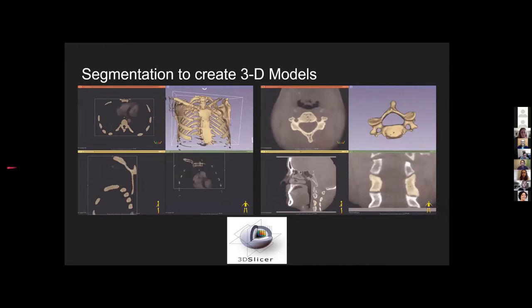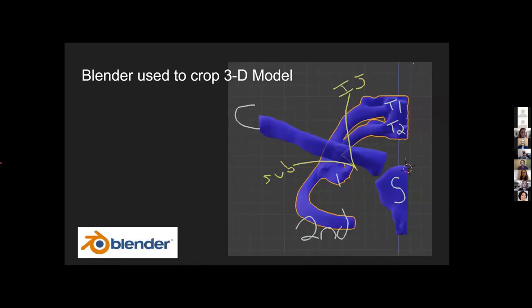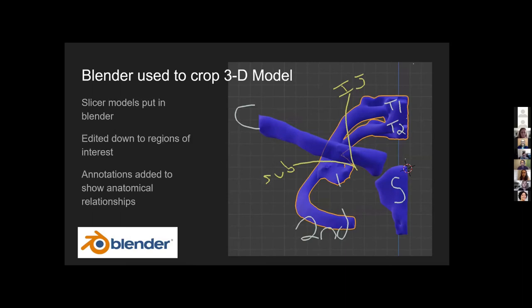So how did we do this? To start, I segmented CT data using 3D Slicer. I segmented the entire thoracic cage and a couple cervical vertebrae. We figured we could start broadly and then reduce the scope of the 3D model. I then imported this into Blender and used it to segment down to our region of interest: the upper right shoulder region, T1, T2, the first two ribs, the clavicle, and the sternum. I also added annotations to show where we'd guide a latex tube.